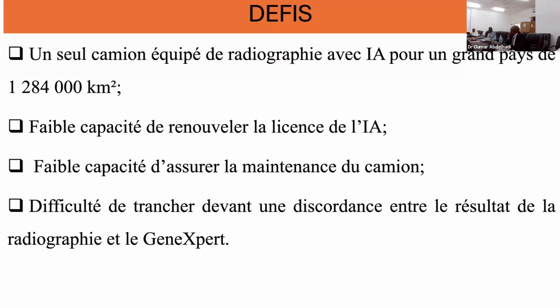But we also have a limited capacity to maintain the truck, because this is a specific truck, and even the equipment inside do not have any specialized people to maintain it. So that's a challenge. So we called Delft Imaging through its representatives in Ghana, and we tried to find solutions to continue to work for those populations.